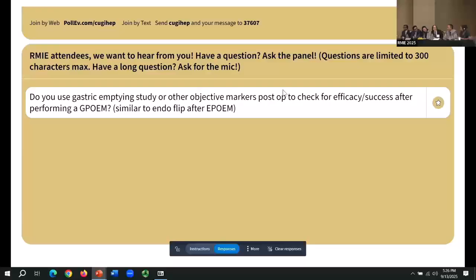Well, I would say lower risk as compared to EUS-GJ, the way we can perform it in this country right now. But again, once you have the experience, as Ken's alluding to, and as shown in that study with respect to proficiency and mastery, then it becomes more doable. But you're making a perforation in whatever organ you're going into, and you have to be prepared to salvage that. And as long as you're prepared to go in with that mindset, then it becomes something potentially worth engaging in.